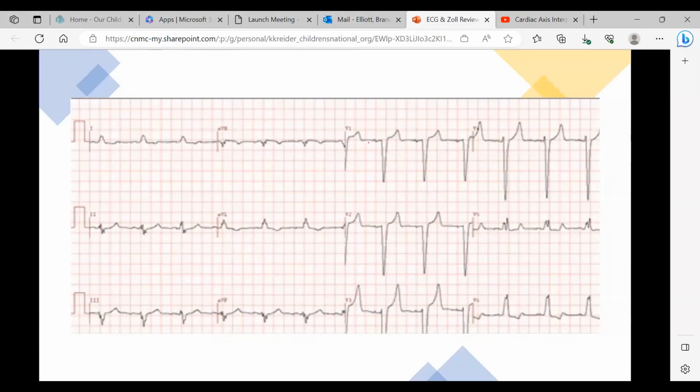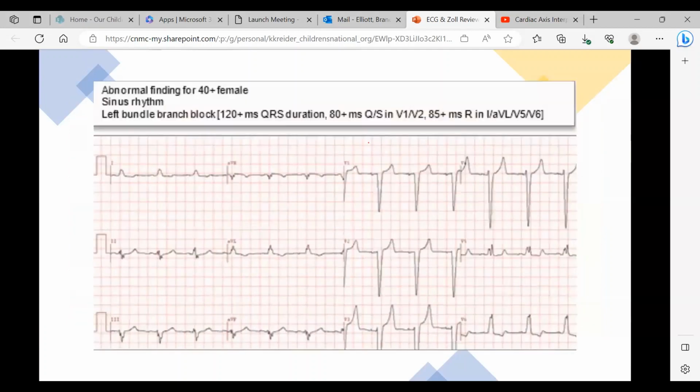It's an ugly EKG, is that what you're saying, Danny? Yes, I don't love it. Survey says, patient has a left bundle branch block, and yes, you're right, QRS is elongated, as well as some ST elevations in V1 to V3. Can we see the left bundle branch block in V5 and V6? Yeah, that's the bunny ears. And then I see it in 2, 3, AVF, right? Those are notched, and maybe AVL. Those all look notched to me. I'm just saying what I see, Danny. I'm not saying I'm right.